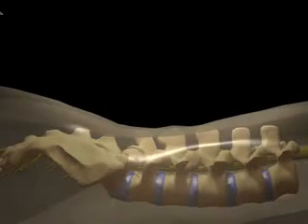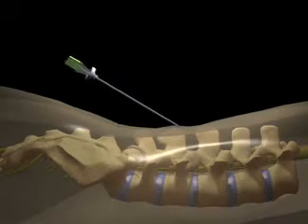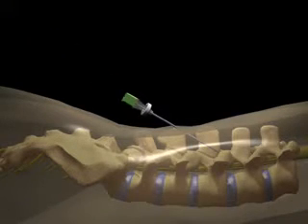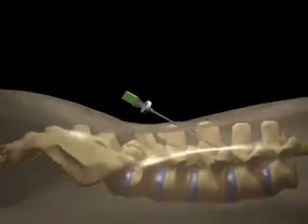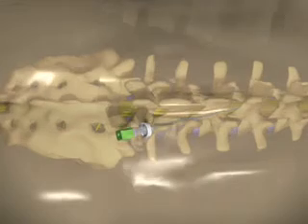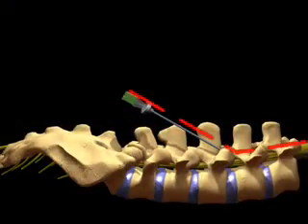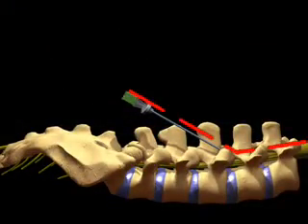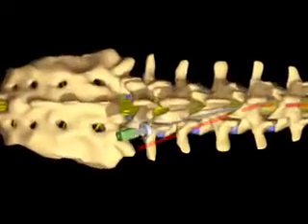A paramedian oblique needle placement technique offers several advantages over the midline technique. With paramedian oblique placement, the site of needle entry through the skin is lateral to the spinous processes. The lateral coordinate for skin entry is parallel to the vertebral pedicle, approximately one to two centimeters off of midline. Entry is one to one and a half vertebral levels below the interlaminar space through which the needle will pass, creating a shallow entry angle.